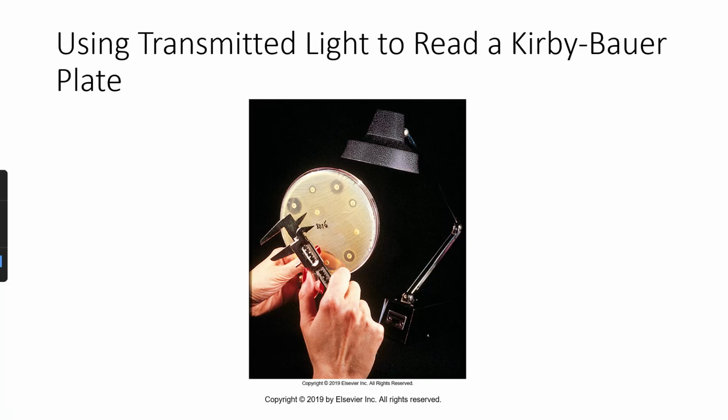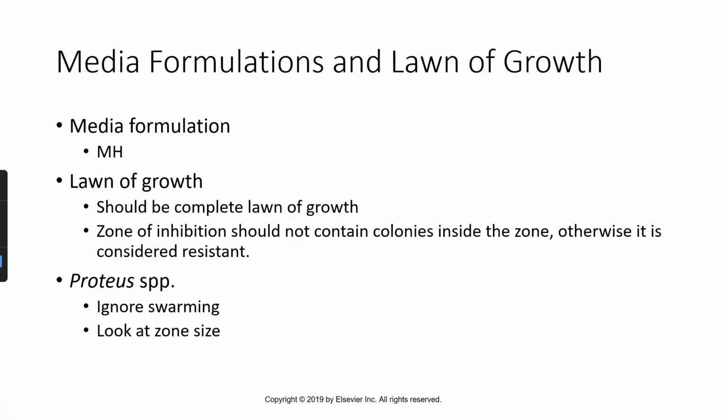inhibition. There are some very specific details that have to go into making this standardized because we want the same system to be used in every country. So if we establish a protocol, we want to make sure that this protocol is standardized across every country, every lab, everywhere in the world that would use it, so that we don't make mistakes and we can get standardized results. That way, if an emerging pathogen is found and it becomes a public health concern that might spread to other countries, we can all share the same data about what we're dealing with.